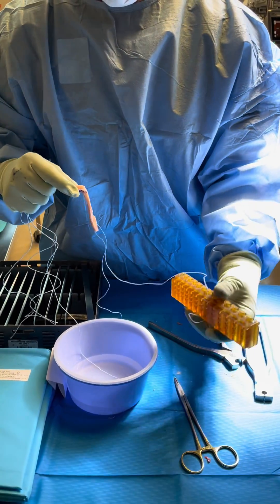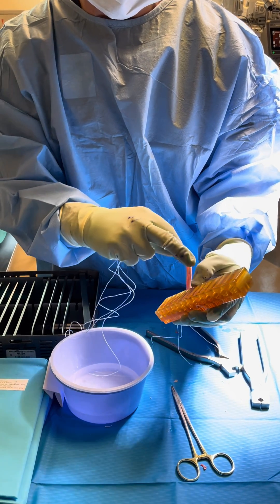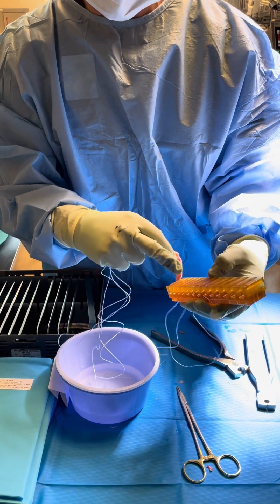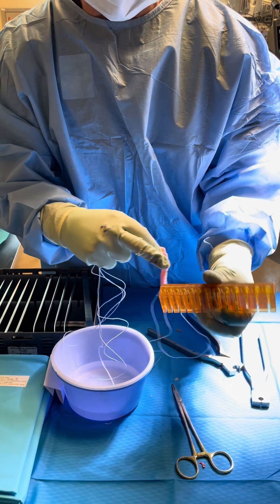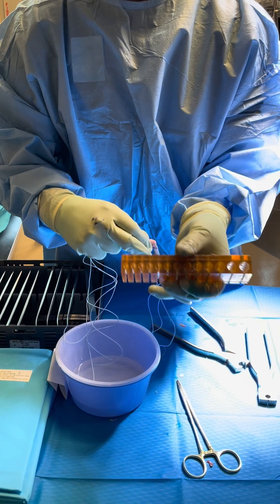This is how we determine the diameter of the graft here. This has got sizes from 6 millimeters all the way up to 12 millimeters. Typically we aim for about a 10 millimeter graft, and you can see we pull the graft through these little tunnels here, allowing us to approximate the size.